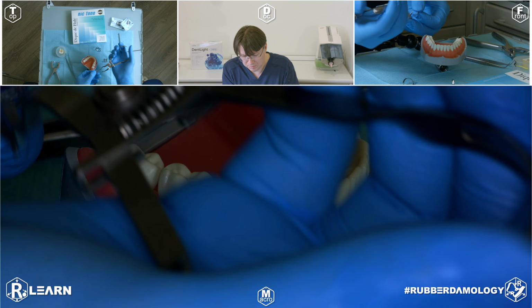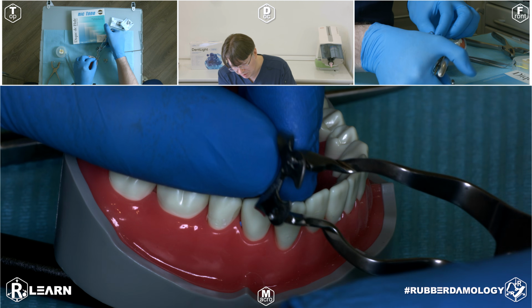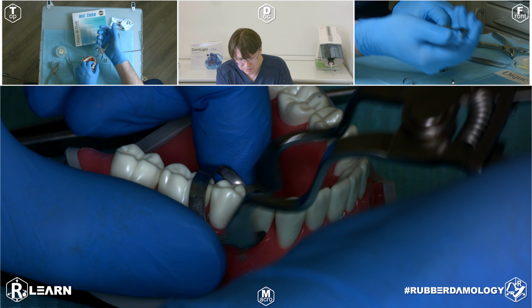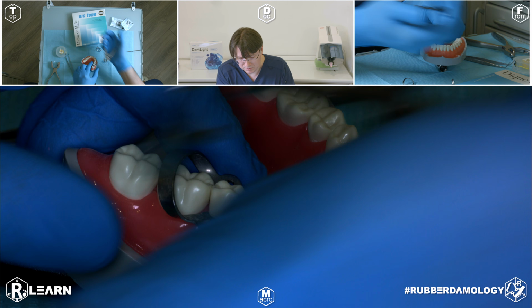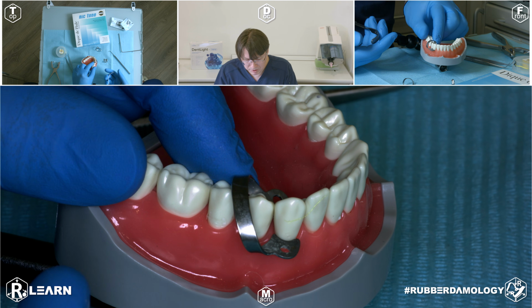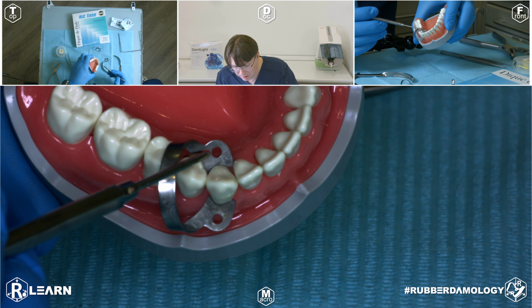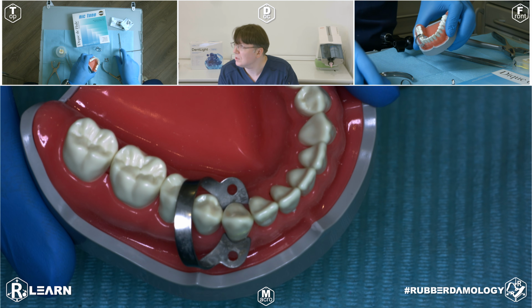For premolars, very useful to work with the clamp WV2. Very good for premolars. First premolar or second premolar. Also, it's possible to use on canine, but pay attention if you have no blocking in this area, so the arc of this clamp is not blocked by the crown part of the first premolar.